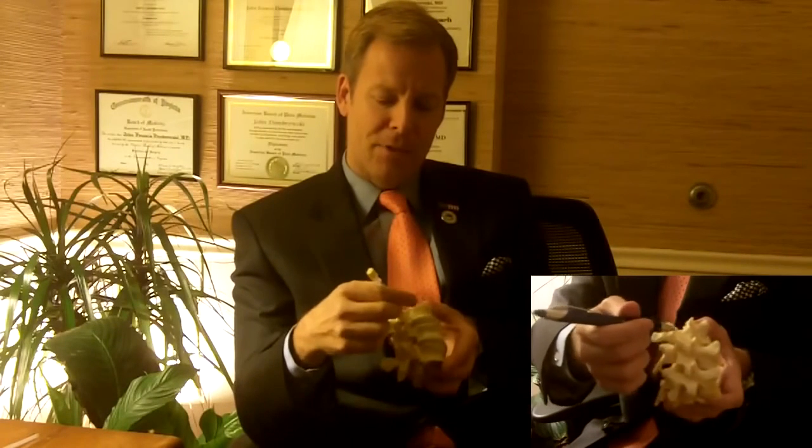So how would we do this? Again, similar spine. What we do is take the needle on the side, again, after we've cleaned the skin off sterilely, we've anesthetized the skin, you put the needle through the side, and then put the needle in the hole right here on the side, right where that nerve root is compressed, or as you have your symptoms. Then we inject the medications. This is, again, a more targeted, probably more elegant injection, with less medication to the patient. And again, you get the same benefit because it's more targeted. The benefit of this is going to be more targeted relief. Again, 1 to 2 days, maybe leaving a bit sooner.